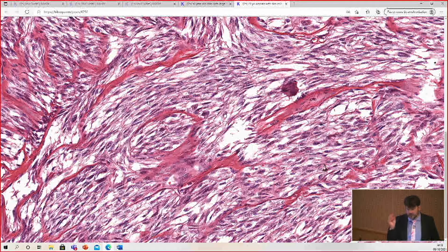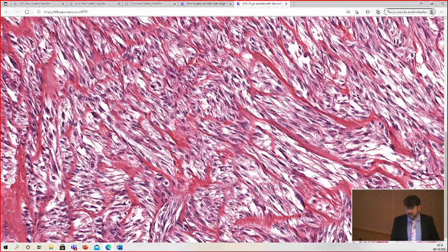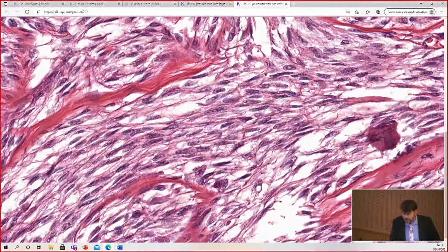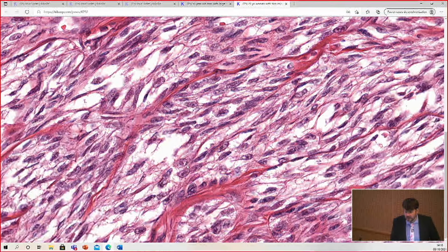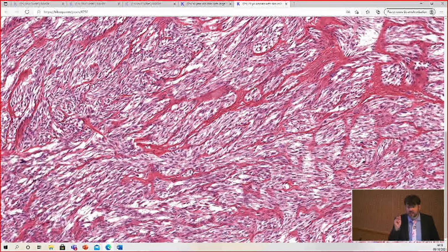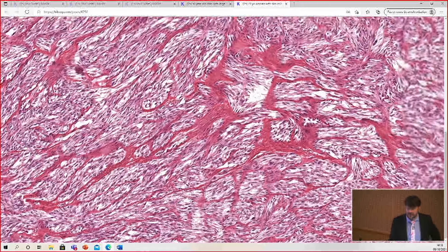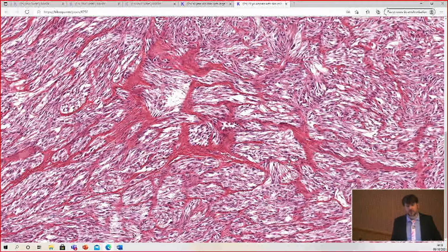He taught me a lot of really great visual tricks and tips in soft tissue pathology that I now pass on to everyone whenever I speak. So the cells are uniform. They do tend to have prominent nucleoli. See the nucleolus there? I'll show you a better area in a minute. Oh, there. Nice nucleolus. Almost that cherry red nucleolus, like the nucleolus of a melanoma, a little bit. The other thing is that in between the nests there is dense pink collagen, dividing these nests or fascicles like this. These features are characteristically seen in clear cell sarcoma.